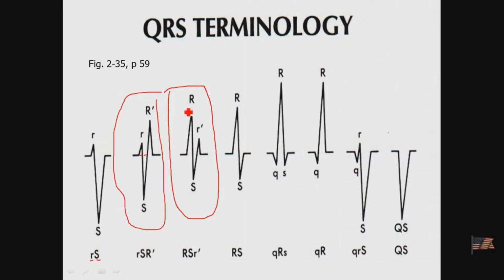How would I determine that it would be a T wave? Because it's like, oh no, this is still the QRS complex. Right, but like the little R on the end. You won't have a T wave until you have an isoelectric line after it. You have to have that. You've got to come back to baseline before repolarization can happen.